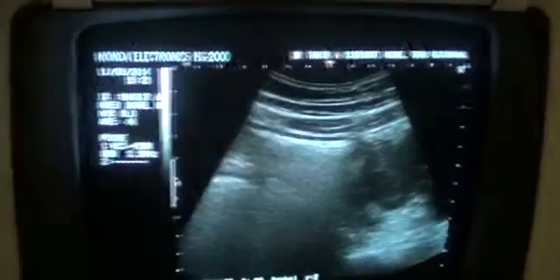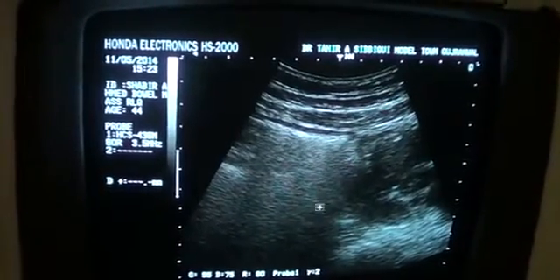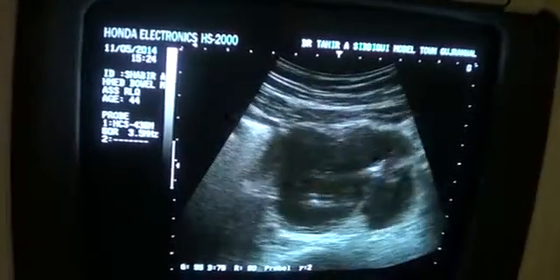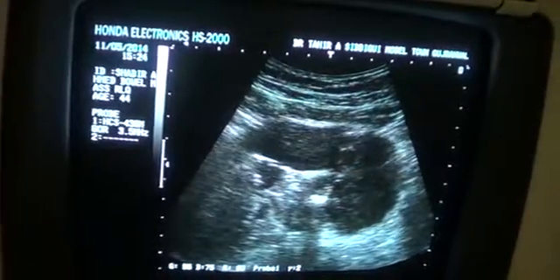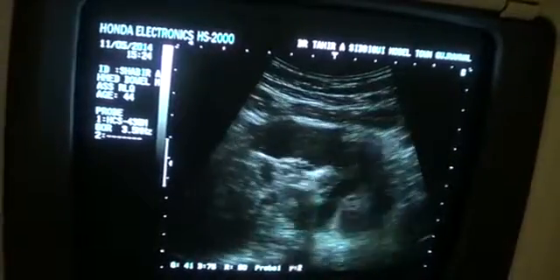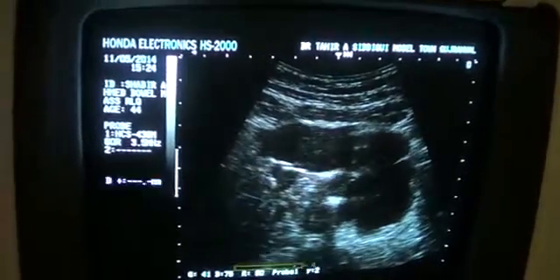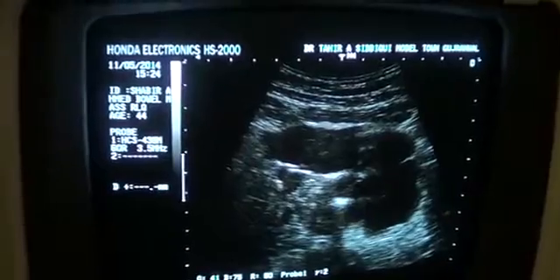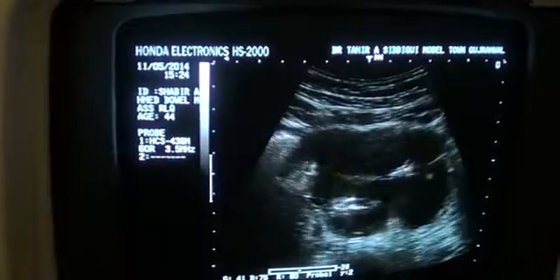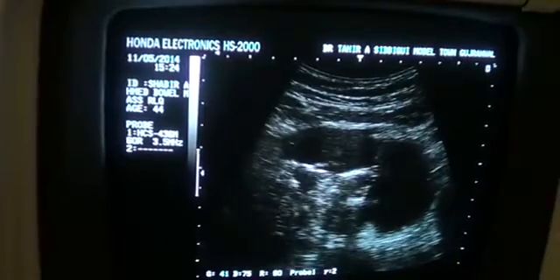Here, if you see, this is a bowel segment giving dirty shadow. From where onwards we see this echogenic mass, a mixed echo mass with fluid compartment and with multiple echogenic areas within it. Now this is air giving comet-tail artifact. This is an air particle. Okay.